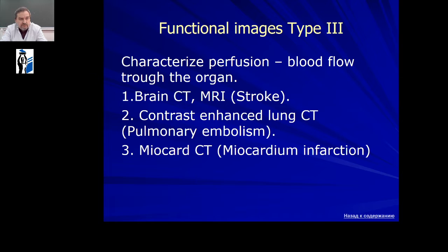Next example, next case is contrast enhanced lung computer tomography, diagnosis of pulmonary embolism. And third example is myocardial computer tomography, diagnosis of myocardial infarction.